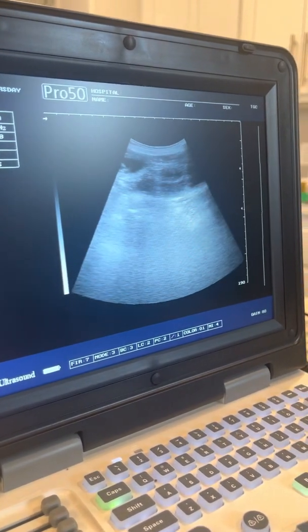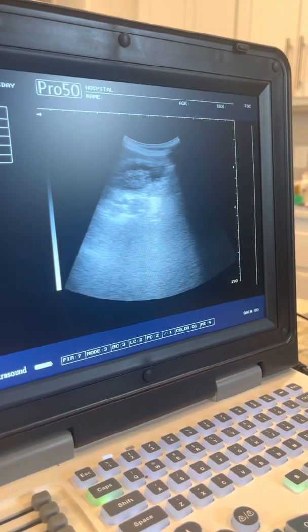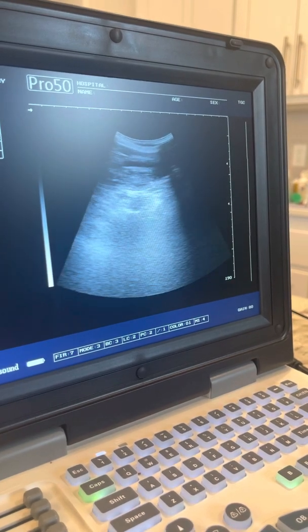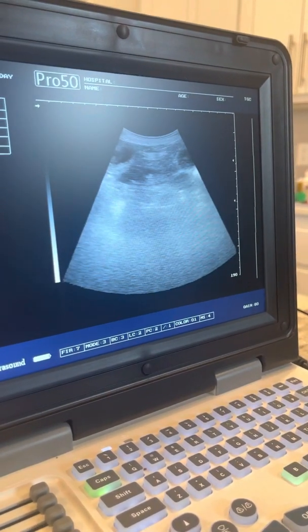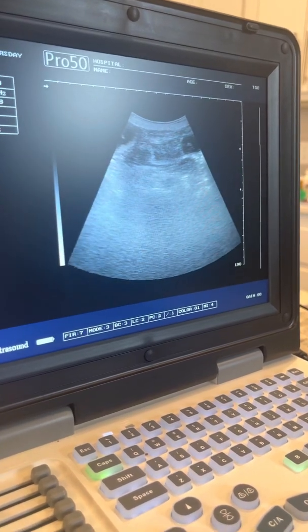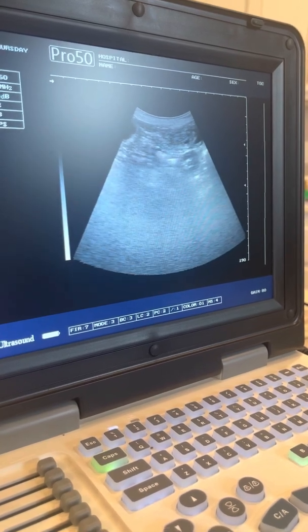I'm estimating I'm going to say six for Minnie, maybe more. But it's sometimes difficult to get an exact number with an ultrasound. Really, the ultrasound's purpose is to confirm pregnancy. Don't do an ultrasound until day 28 or so.